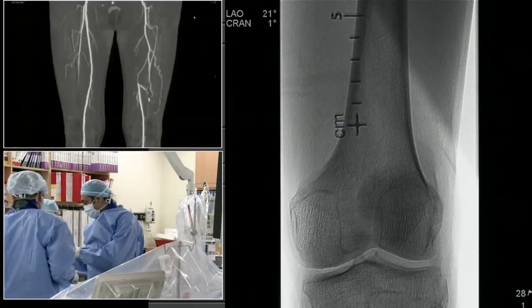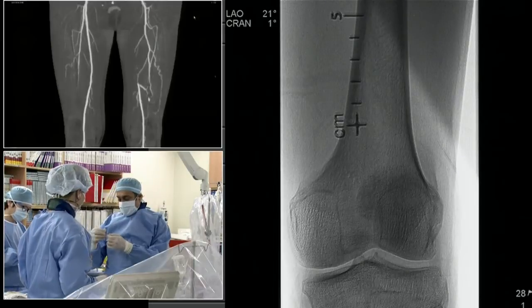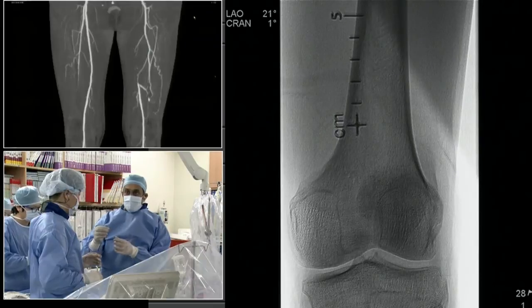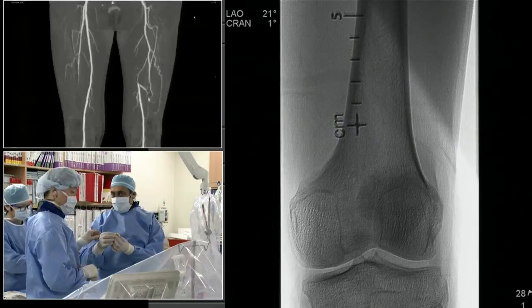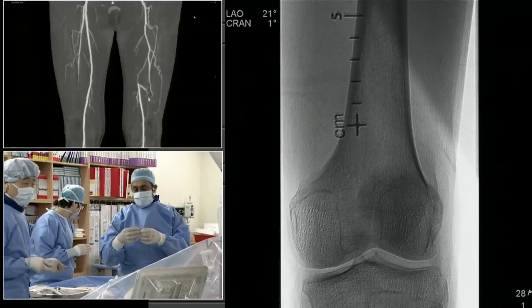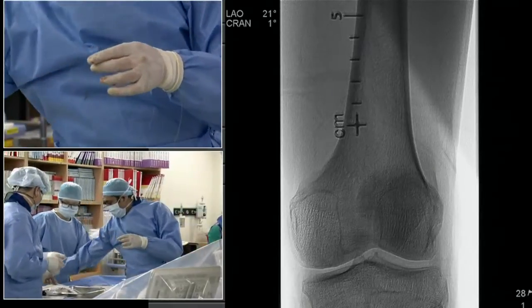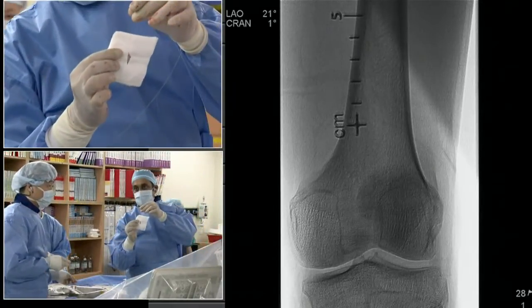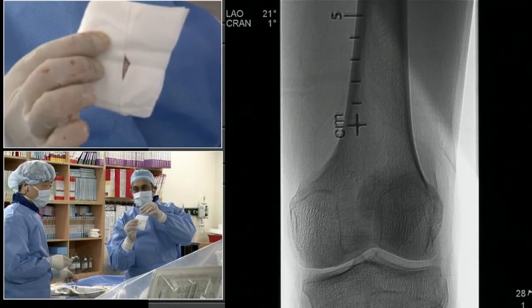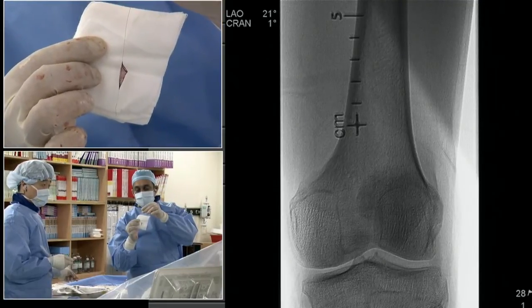He's a lucky smoker for not having any infrapopliteal disease. So we have a little bit of plaque at the very tip of the spider. It's not chock full of plaque, but there clearly is some plaque over there. I don't know if we can zoom in on this. His anatomy is somewhat interesting, too. It's just unilateral disease; the other side looks fairly clear. It tends to suggest something, some ulceration which would progress over time. I don't know if that's visible to you guys there. There's some small plaque there at the very end. Yeah, small pledget. Okay.